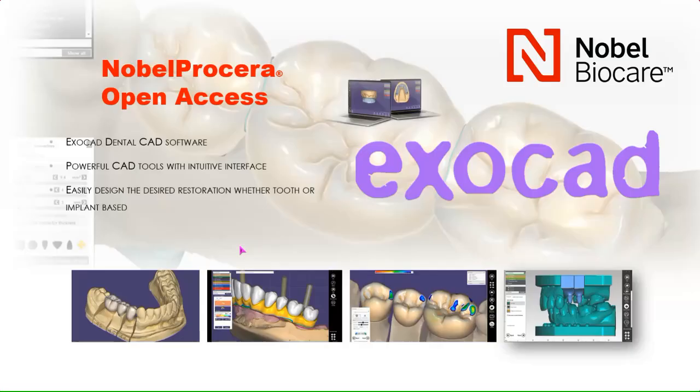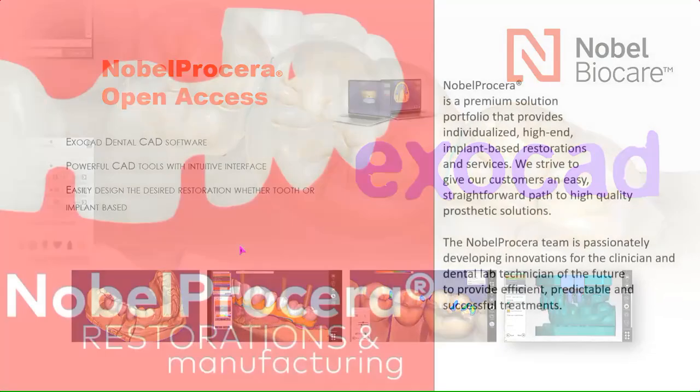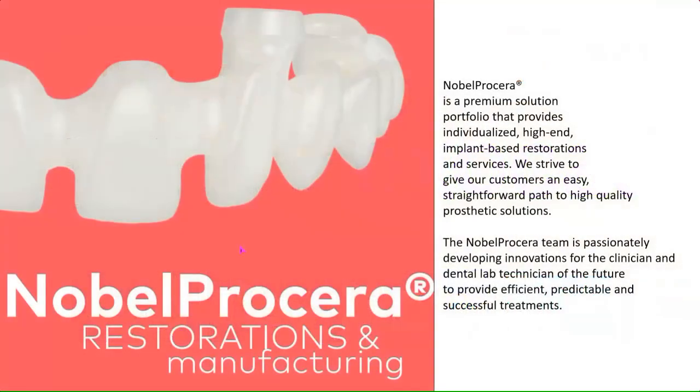But we're very pleased now to have access to native exocad, dental CAD, where we can design all of our NobelProcera restorations, specifically our NobelProcera implant bridge, which we will be focusing on today. With our NobelProcera restorations, they are premium solutions. And they're individualized, implant-based, screw-retained, and we give our customers just a straightforward path to very, very high-quality prosthetic solutions, which we will talk about a little bit later.